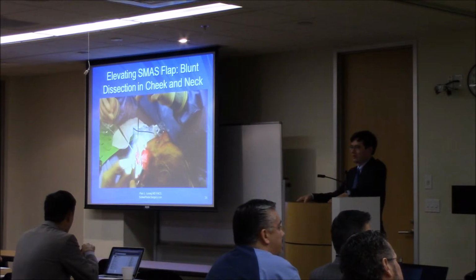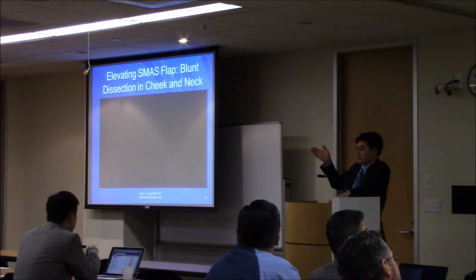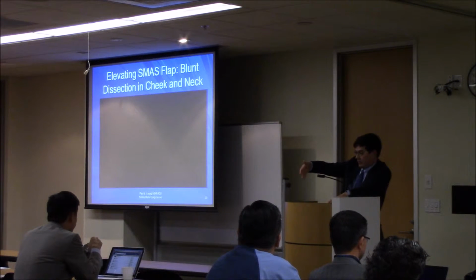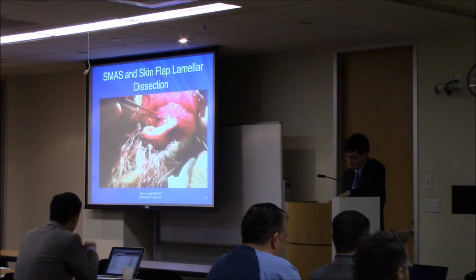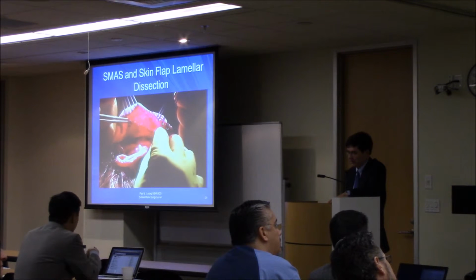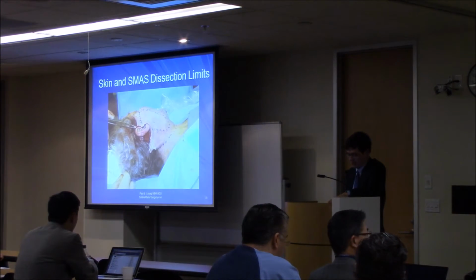So I gently elevate the SMAS. What I do is turn that nasal speculum forward initially, and then turn it straight inferior. So I'm 5 centimeters beneath the mandible, and when I have that flap up completely and I'm certain the nerve is not in there, I just cut it. Okay, and so here we go. This shows almost the full extent of the SMAS flap in the high SMAS incision, elevated. We're not seeing the inferior component completely, but that's almost the entire flap.